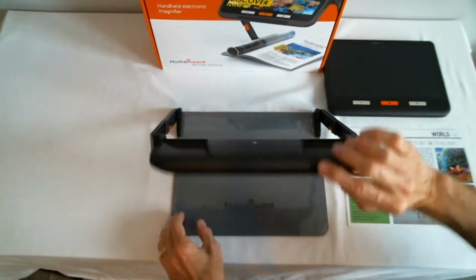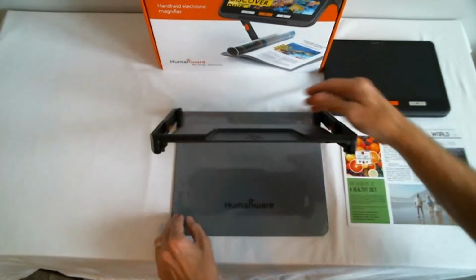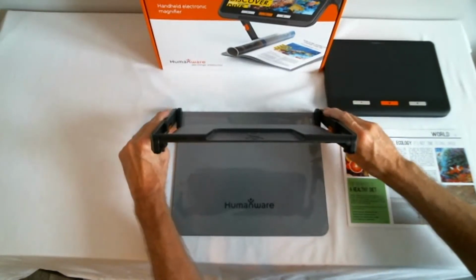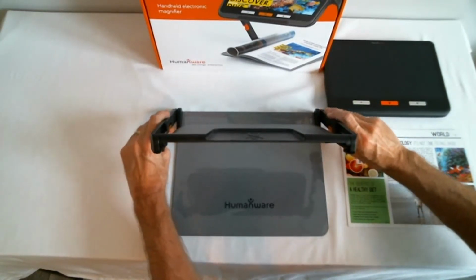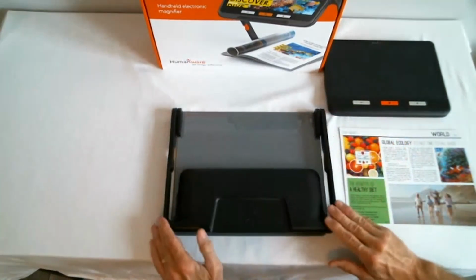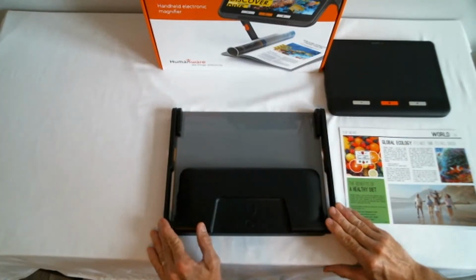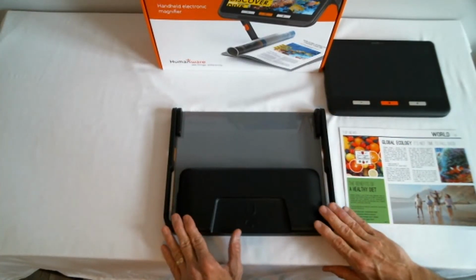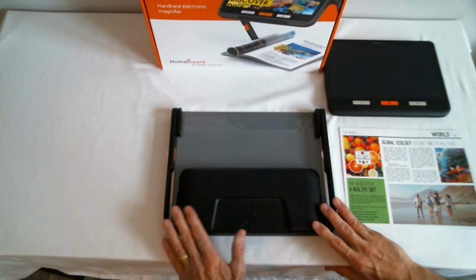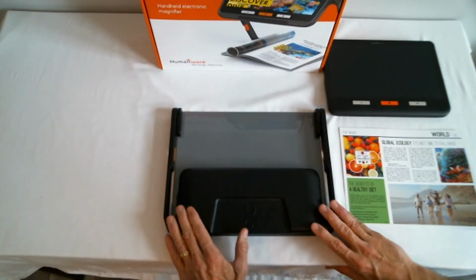So I just lift my device tray, rotate it back around. And then if you'll recall, there's those two buttons on either side. They're orange buttons that have a nice curved spot where you'll feel your thumb fall in. Press each of those in and lower the arms until it folds back into its fully folded position. And now it's ready to be stored in your carry bag or moved from location to location to use it where you need to have the folding stand.